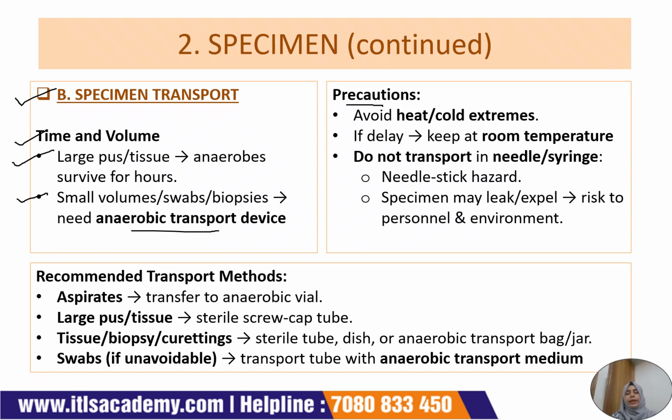First, we have to avoid extreme conditions of heat and cold, and if processing is delayed, we should keep the specimen at room temperature. We should not transport our specimen in a needle or syringe. Why? Because there is a needle stick hazard, and the specimen may leak or expel, which increases the risk to both personnel and the environment.